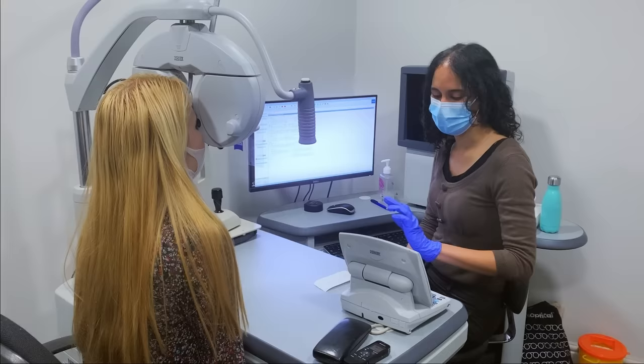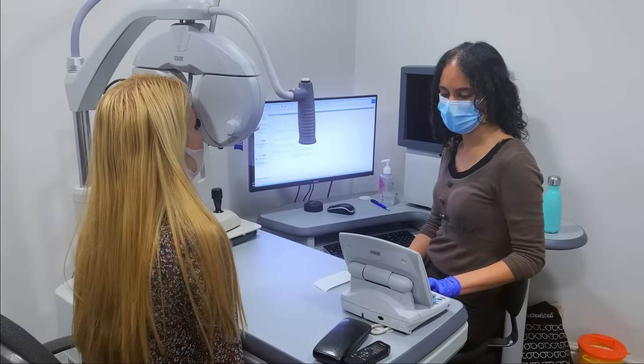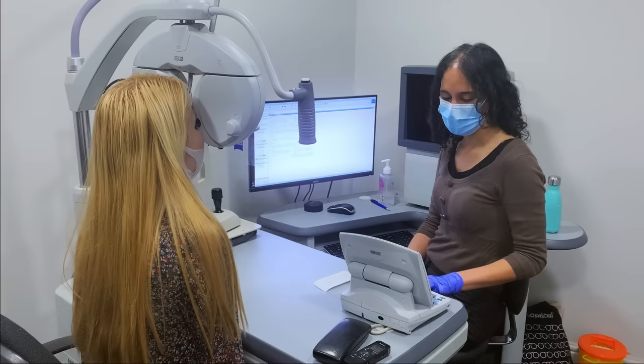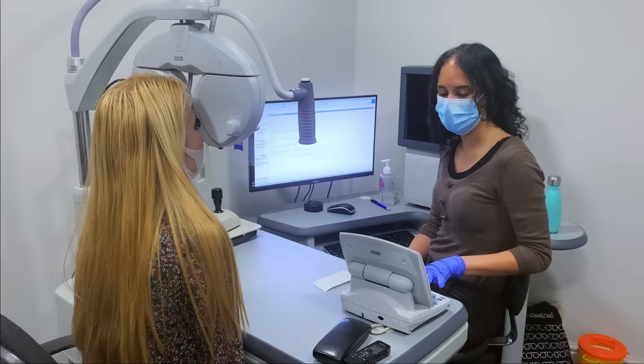So now if you look at these black circles, are they clearer and rounder with either number one or number two? Oh, are they the same as each other? That was number one. And that was number two. I think more or less the same. Good, so it's a valid answer. And then between number three now and number four. Number three is better. Okay, good. And then between number one now and number two. Number one. Okay, great. Good, excellent.